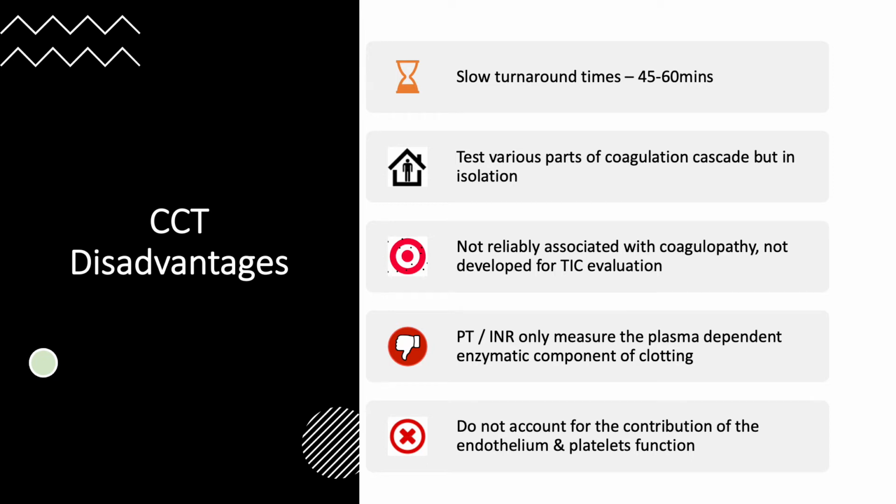Actually, CCT was not designed to evaluate TIC. Other than that, PT-INR only measures the plasma-dependent enzymatic component of clotting. In other words, it only measures a portion of secondary hemostasis. Finally, it does not account for the contribution of the endothelium and platelet function.